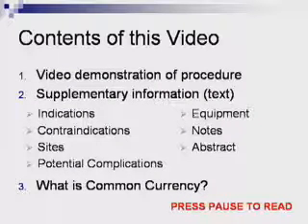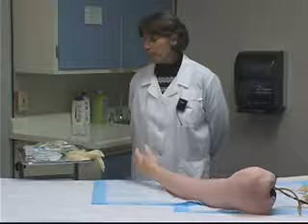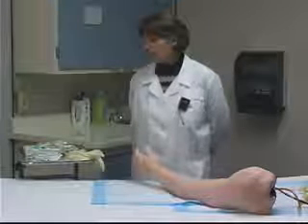Before beginning any procedure, be sure to wash your hands properly using the accepted technique and follow all applicable universal precautions. In this procedure that involves protective eyewear and gloves. This procedure is the insertion of a peripheral IV. The equipment that you'll need is as follows.